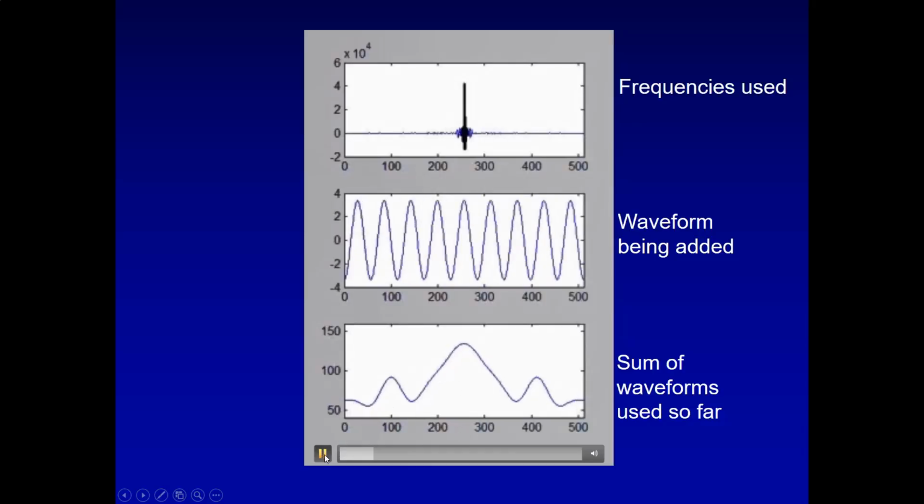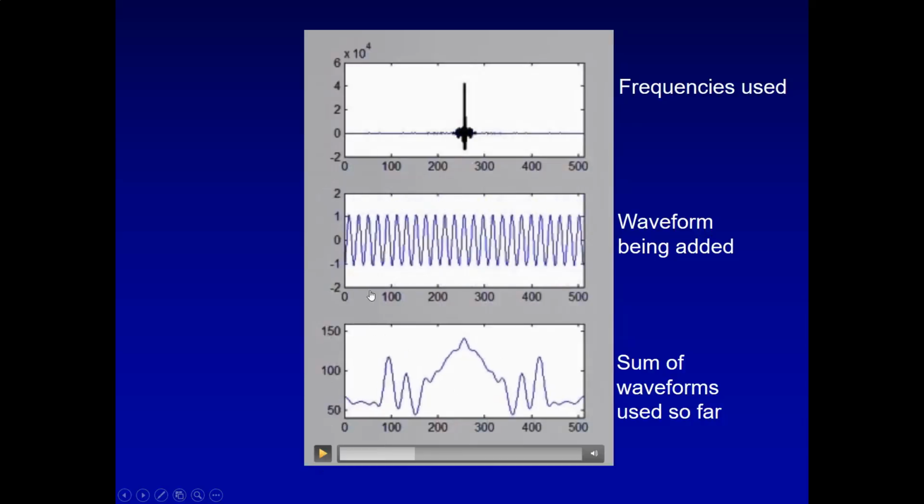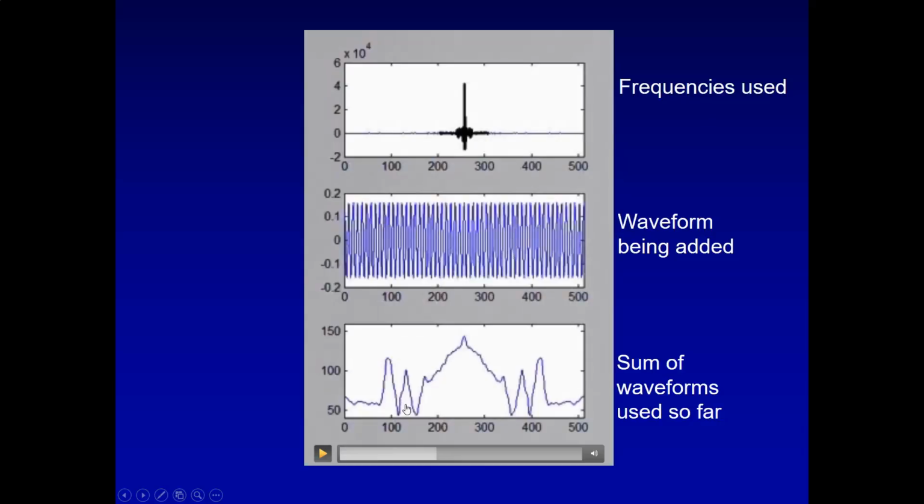If we let that run a little longer, I stopped it again. The frequencies are rising, and the object is beginning to pick up some more detail. And now we're at much higher frequencies, and we're really picking up. You can even see the little detail at the top of the main dome. We go to extremely high frequencies, and we're really picking up more information now.